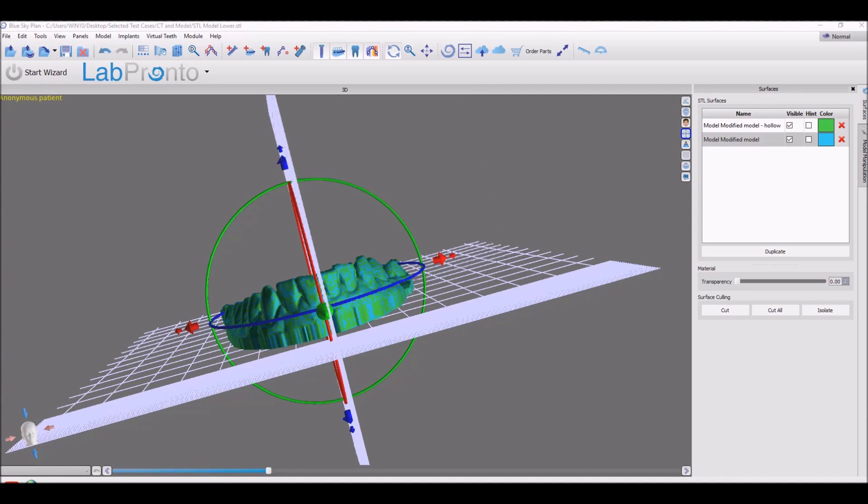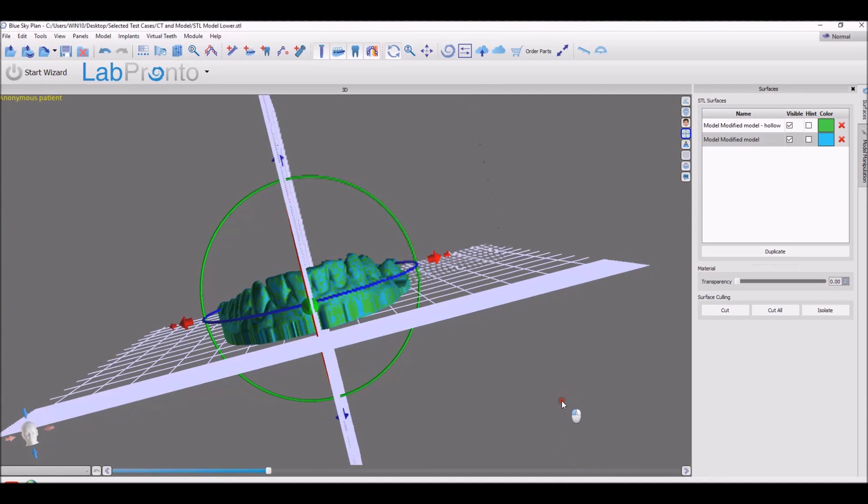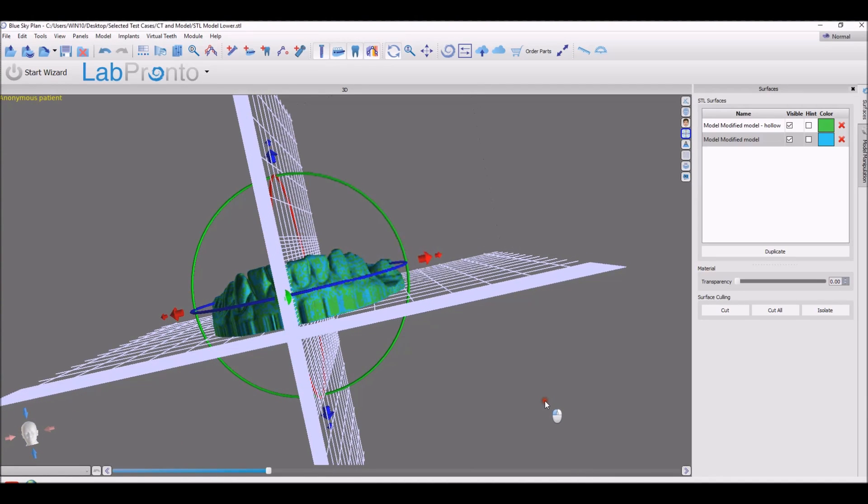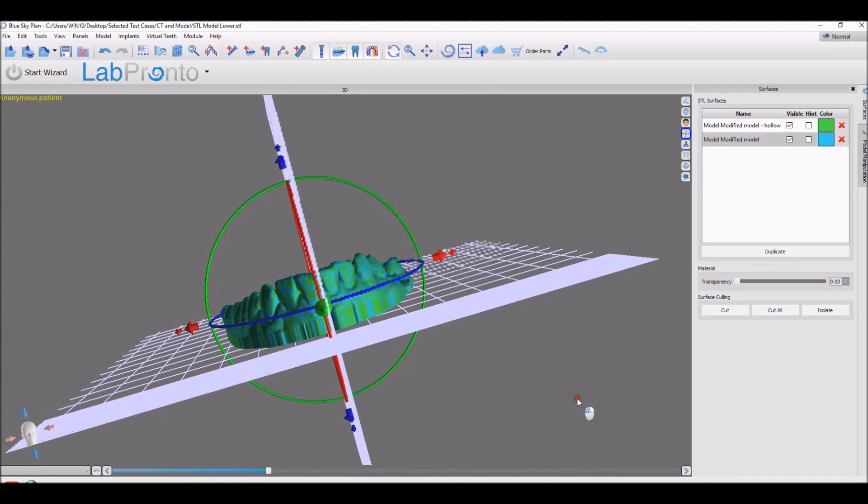In this video, we're going to go through some of the new features and functionality in BlueSky Plan version 4.5. We're not going to explain them in detail, rather give an overview of some of the new features that are included in this release.